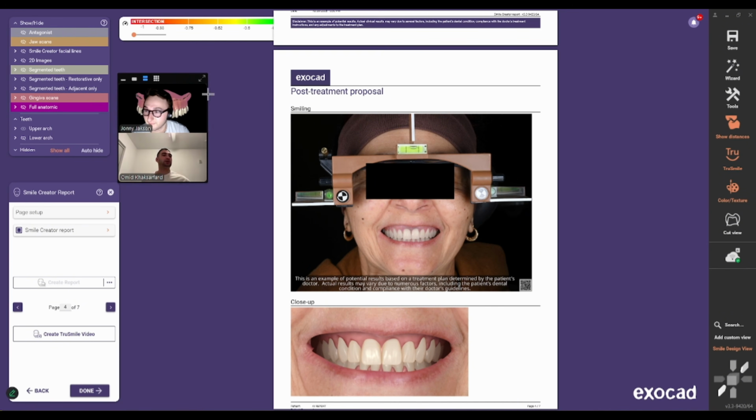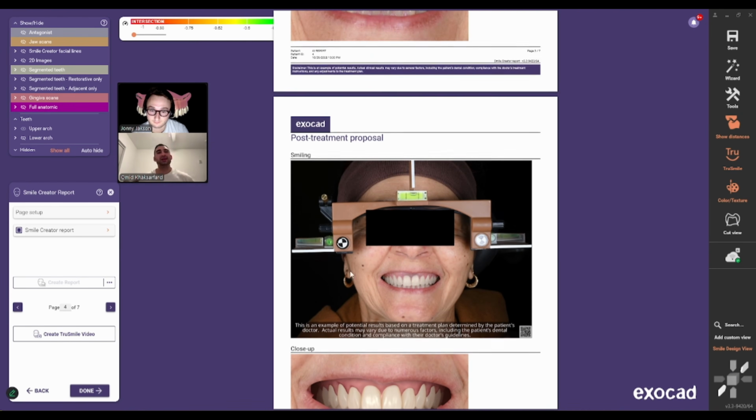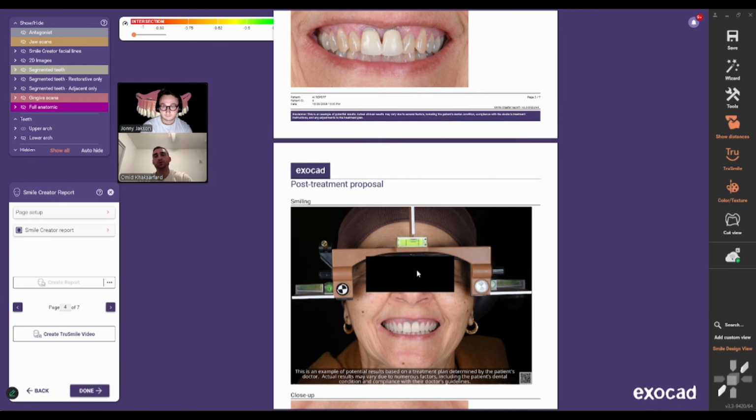It helps, and it really doesn't take much to do this, right? You present it, and of course, sometimes people don't want it, but at least you tried. You plant that seed of value, how much they value their smile, and they want a doctor who equally puts that investment into them, and they trust you more with completing what they want.